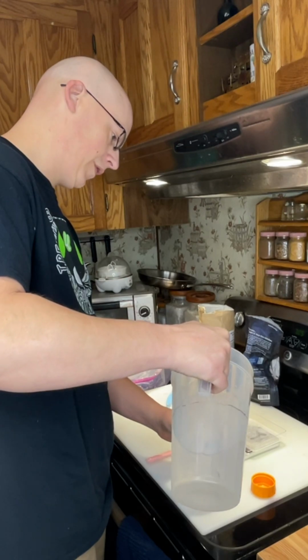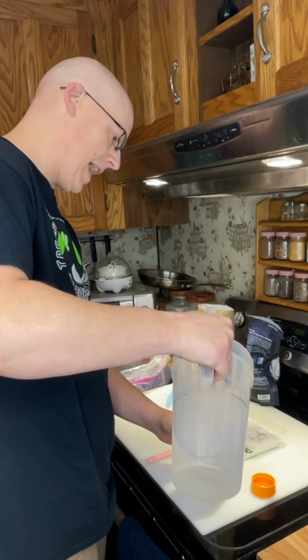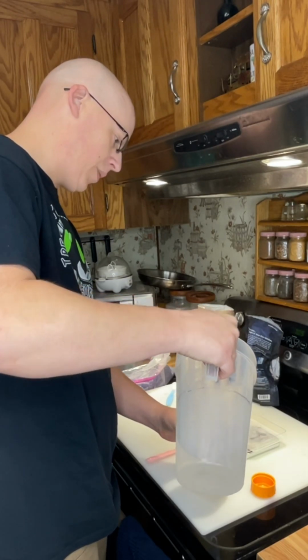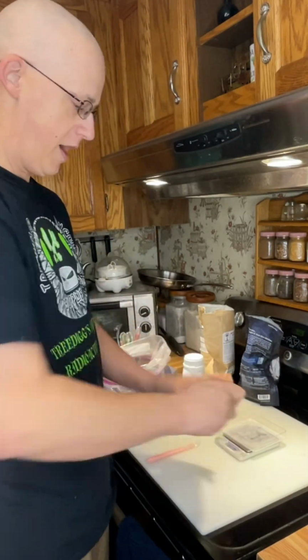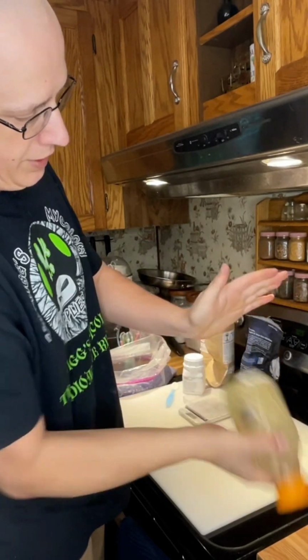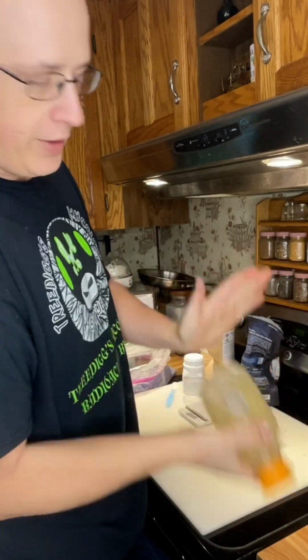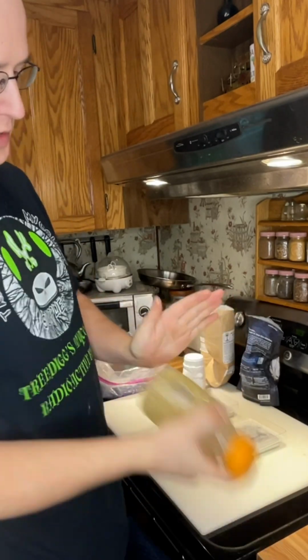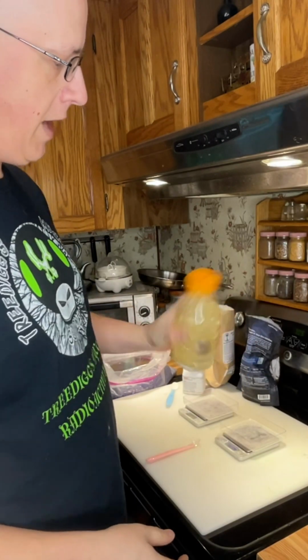And the reason we use ice water is because Gellan gum hydrates so fast. The warmer the liquid, the faster it hydrates. Even ice water, as you'll see here, only gives us a few seconds to get it mixed up before it completely gels. And you may even get like this, where you see I've got powder that doesn't want to come off. So even in this case, I've got lots of powderies that don't want to stick here. So, not ideal.